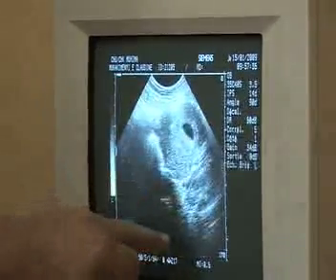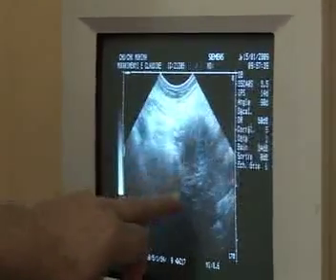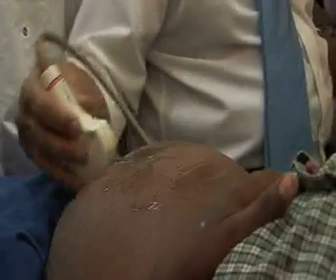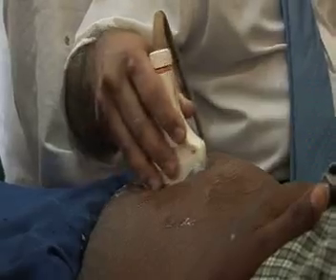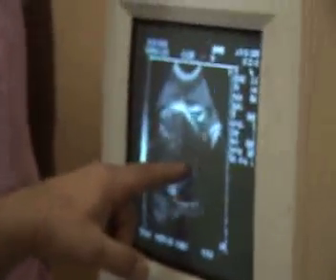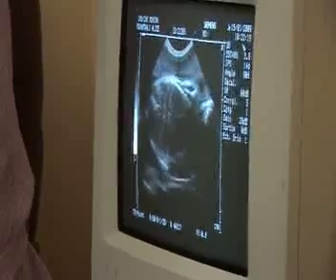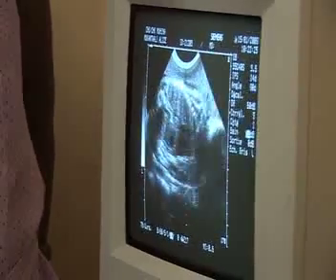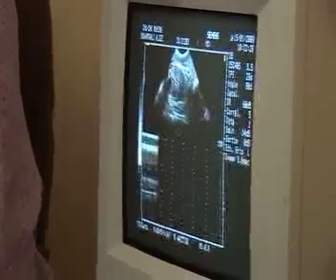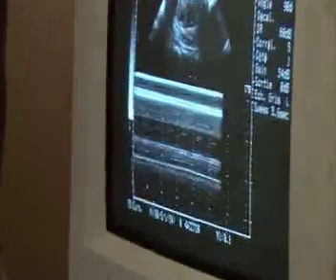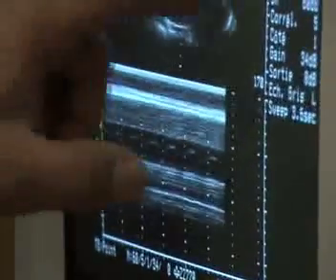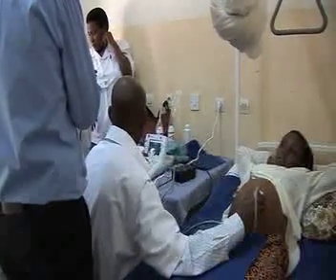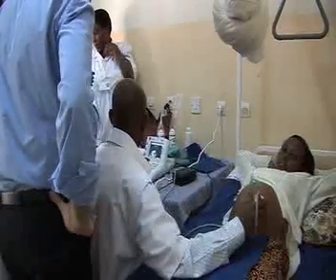You start to see the gestation sac — just keep coming all the way out. The placenta is anterior. Now I'm going straight up — make sure that the heart is beating. And if you want the heartbeat, this is your M-mode. Place your cursor on the M-mode right there, and then you'll get your fetal heart rate as well.